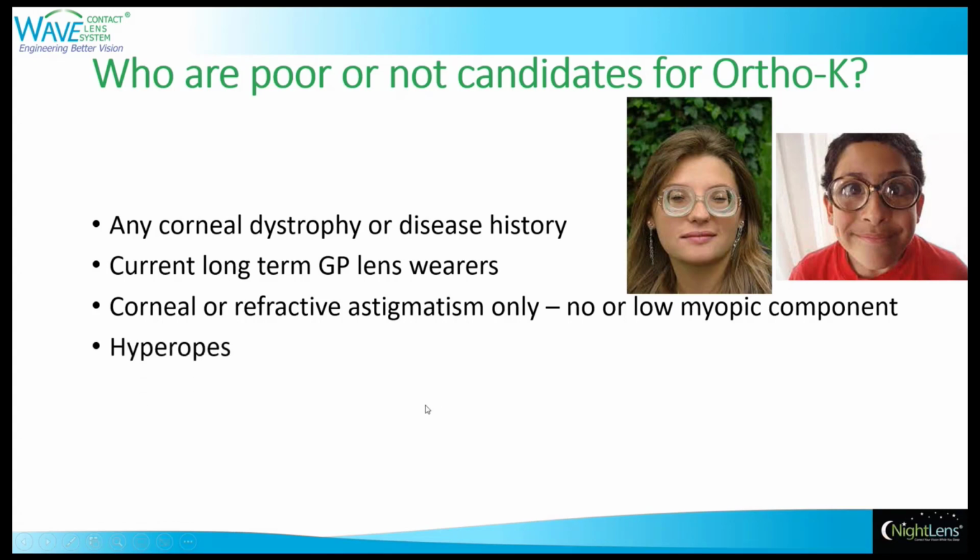Hyperopes. Hyperopes are an interesting group because you're actually doing the opposite of what you do with a myopic candidate. Rather than flattening or compressing the central epithelium for myopes, what you're doing is increasing the central epithelium for hyperopes.